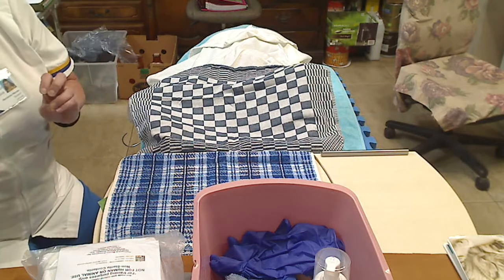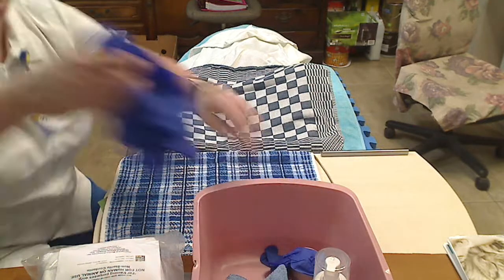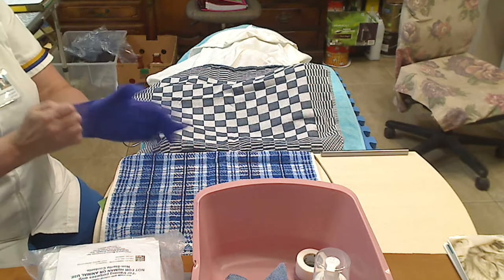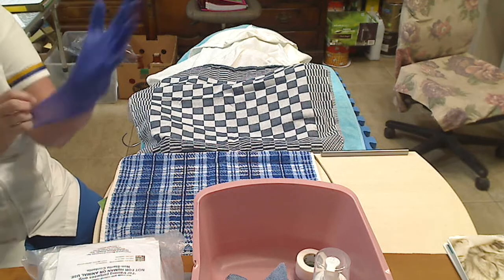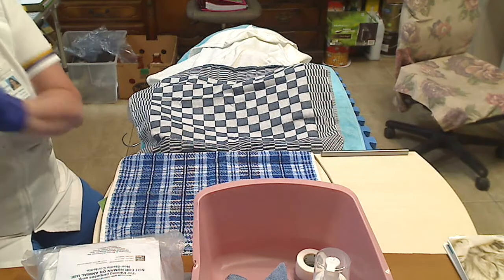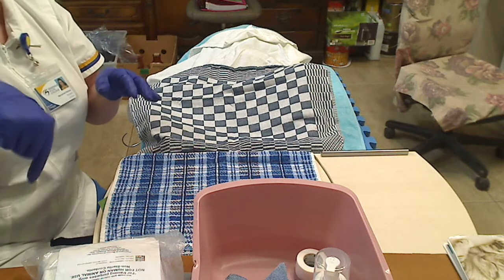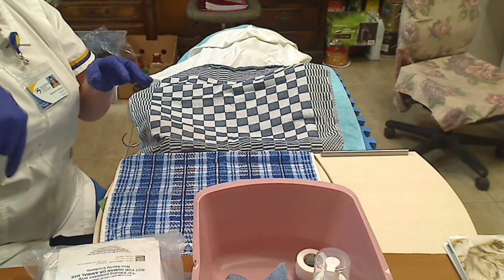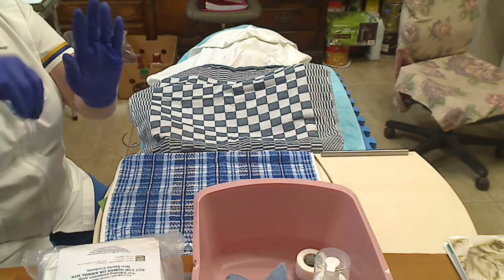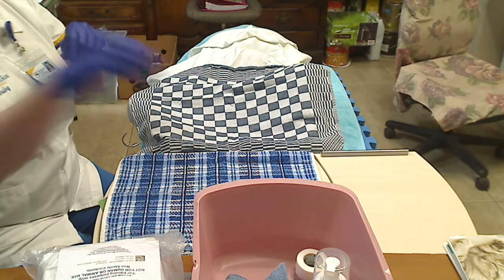Okay. So I will go ahead and put on my first pair of gloves. They're just procedural gloves. I have already closed the curtain to make sure that she has full privacy. The door is completely closed as well. I have my gloves on. I've already got a trash can established just down here to my side, so I will not be breaking sterility. When I drop, I'm keeping my hands above my body and just dropping. You won't be able to see it though, unfortunately, but I'll try to put my hand closer in so you can see it.